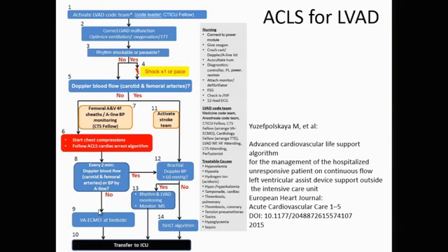And that's exactly what we do at my place. These people end up in a circulatory crisis. We can't sort out what's going on with their LVAD and their heart. We'll take these two 4-French cannulae that you put in the femoral vein and femoral artery, convert them to ECMO cannulae, just put them on ECMO and sort it out. And that's really important. Most people who have an LVAD in who are perceived to be viable aren't going to die until they've had a course of ECMO.